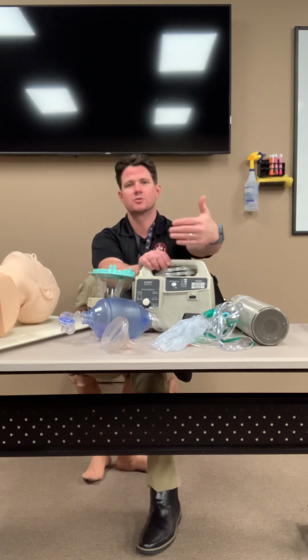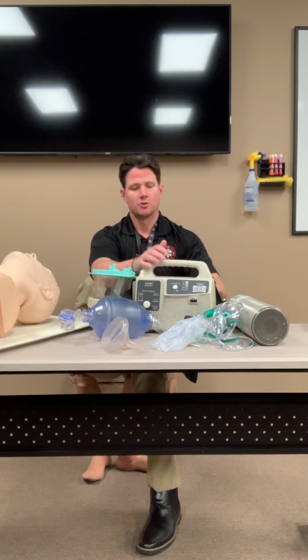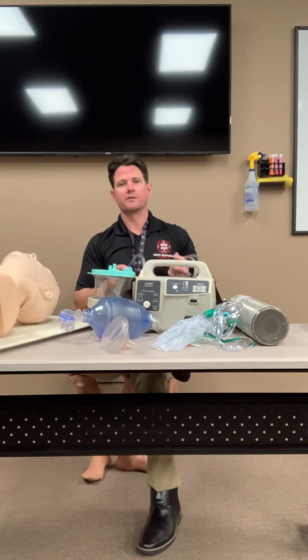So everything you hear me saying, you should be verbalizing in your own way, okay? First step, turn on the suction unit, right? You are doing upper airway oropharyngeal suctioning.